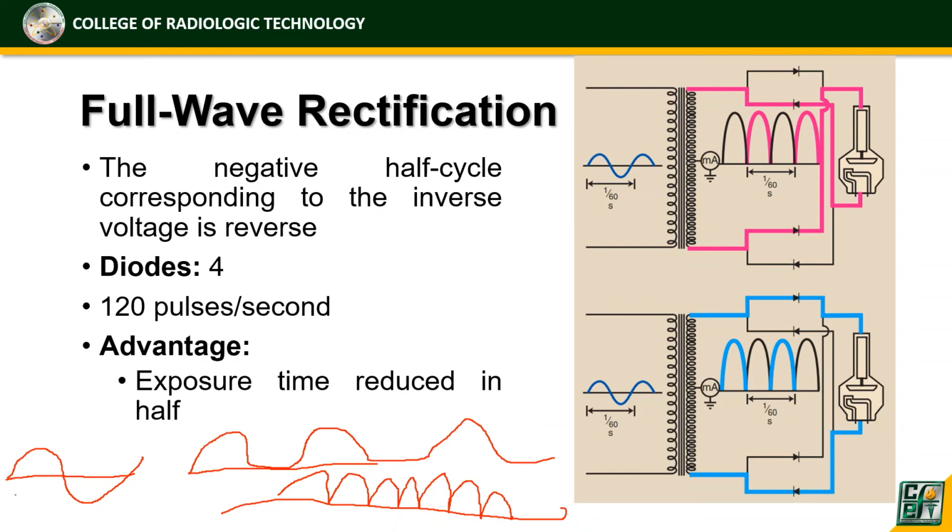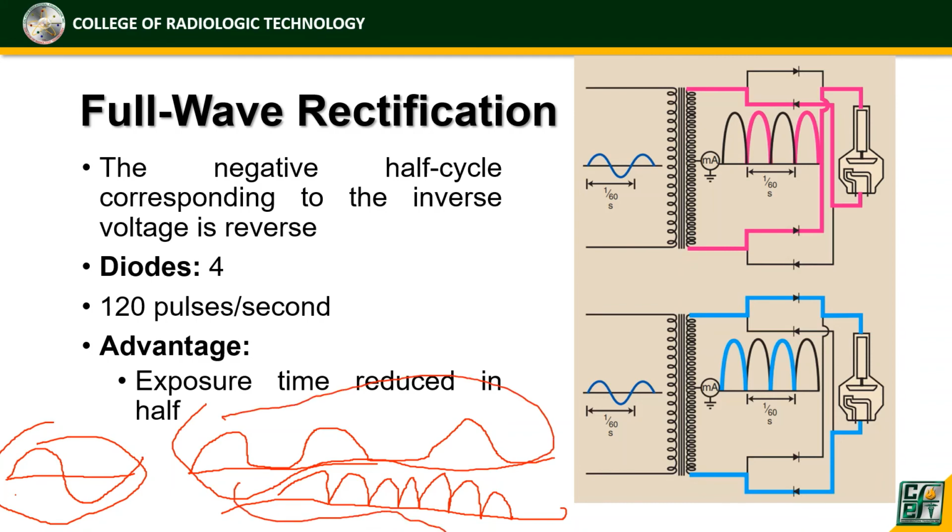The normal AC voltage waveform, the half wave rectification, and then the full wave rectification. Two diodes, four diodes.